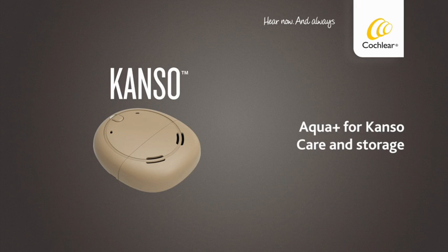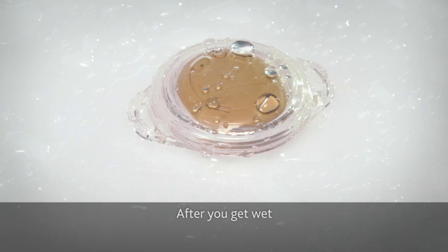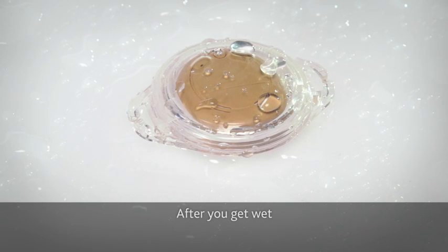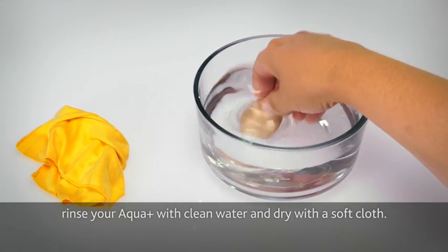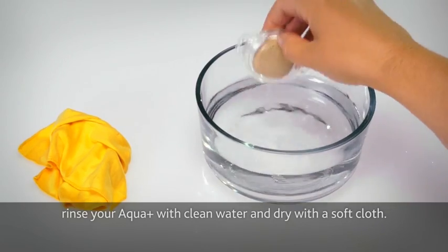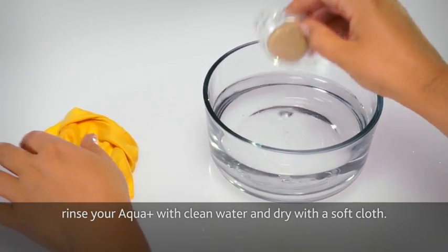Aquaplus for Kanso: care and storage. After you get wet, rinse your Aquaplus with clean water and dry with a soft cloth.